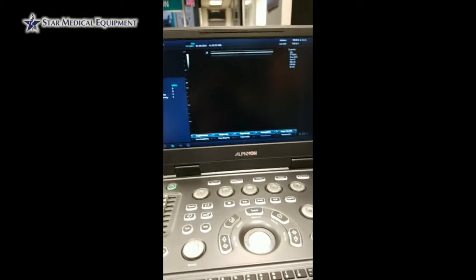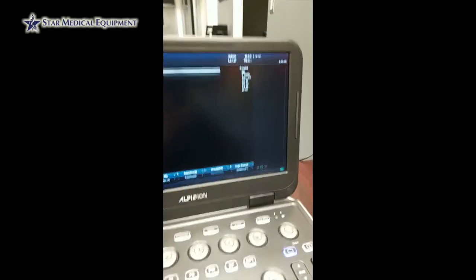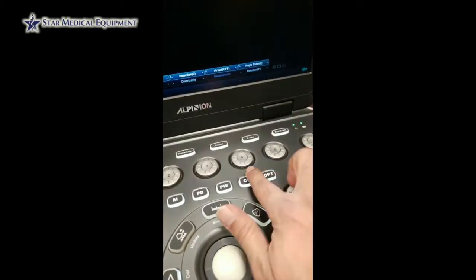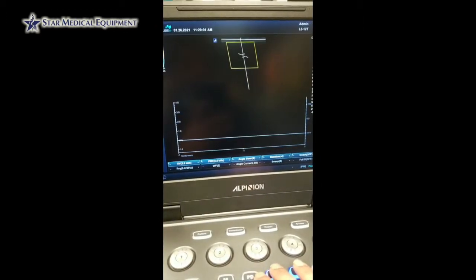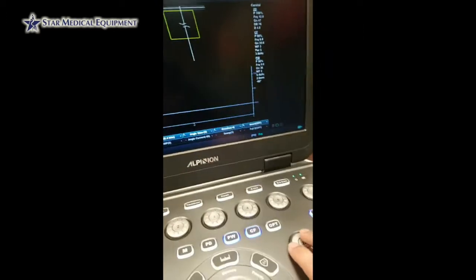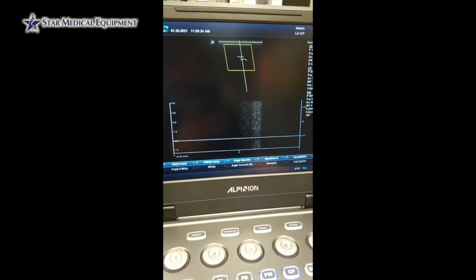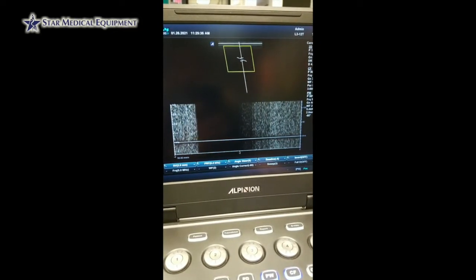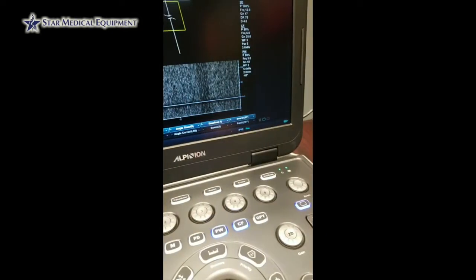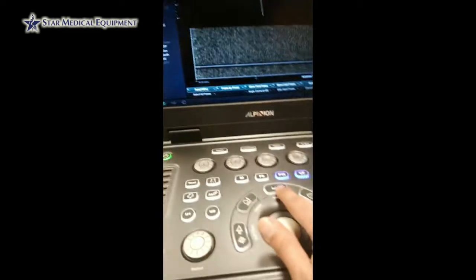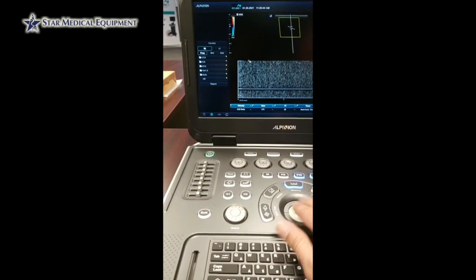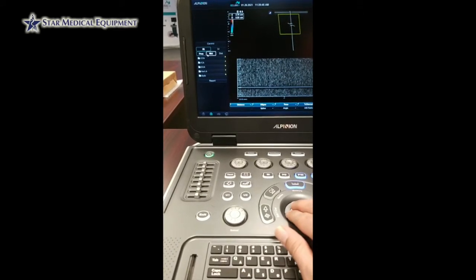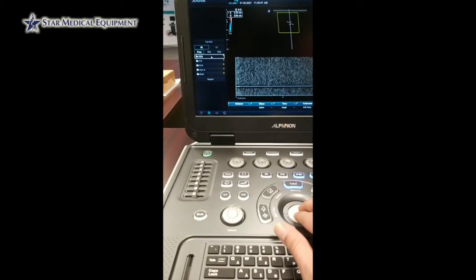The next thing I'm going to teach you is how to do the specialized measurement. In this case we're doing a carotid, so I'm going to turn on the color flow, turn on the pulse wave, and let's say we have a nice wave here that we need to measure. I freeze it, press the measure button, and you will see that it populates right or left, proximal, mid, or distal, CCA.